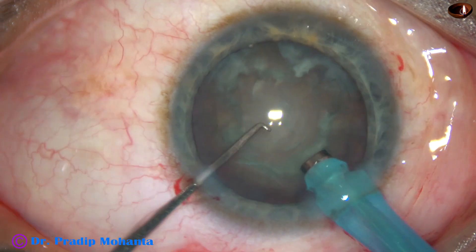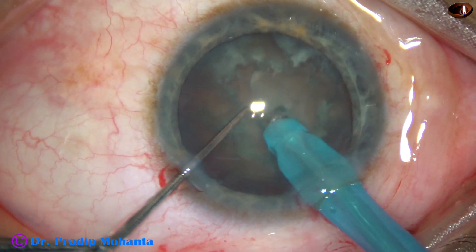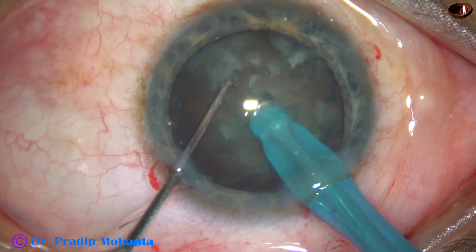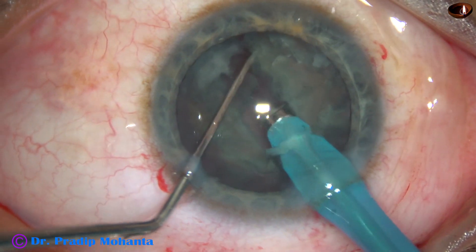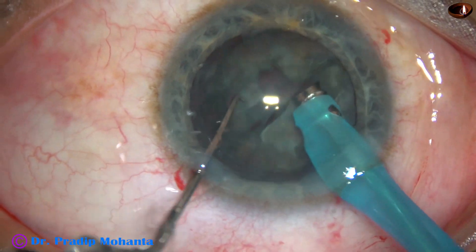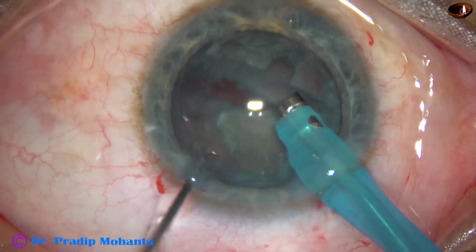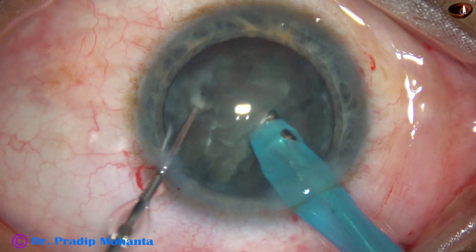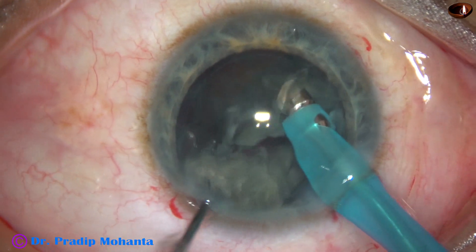And now, direct chop. The tip is buried into the substance of the nucleus. The nucleus is held firmly and it is chopped into two halves. Now, as I try to hold this hemi-nucleus, there is a pit in front — I could not hold it. So, let it be like this. I come to the other hemi-nucleus, hold it and chop it into two fragments.